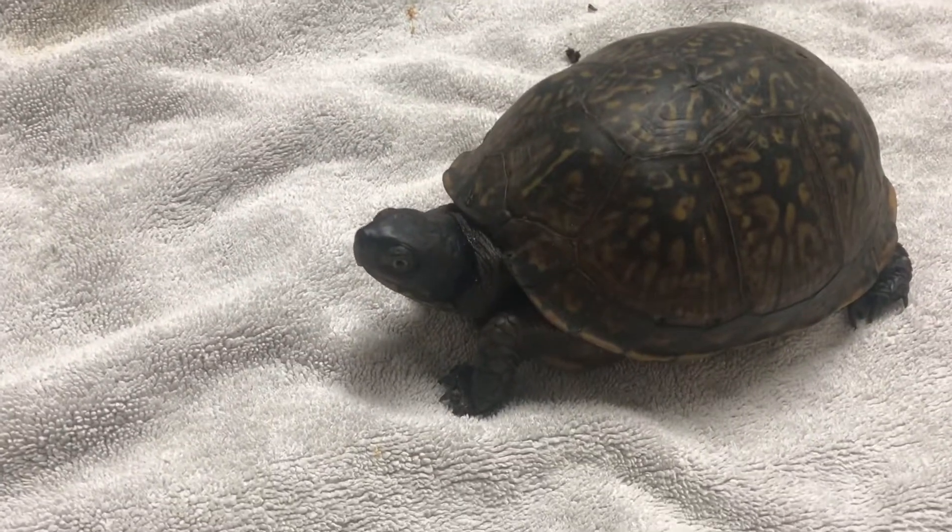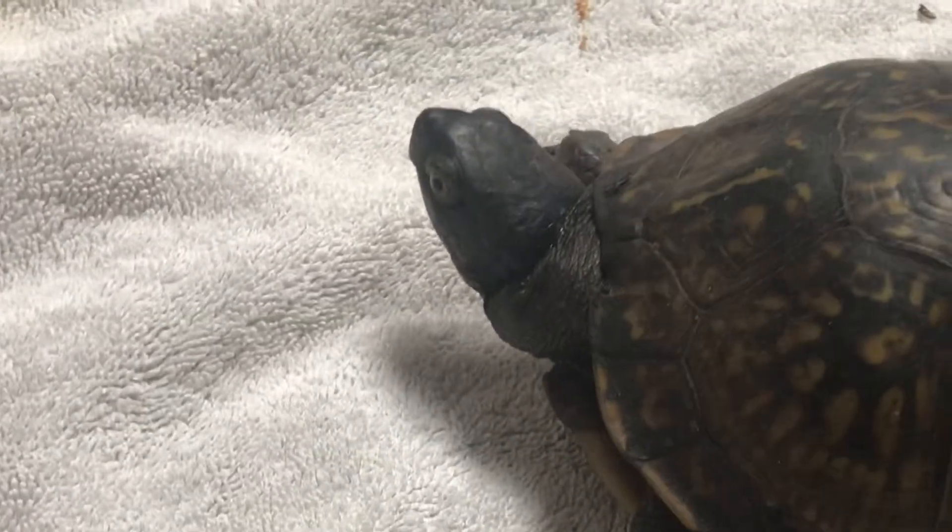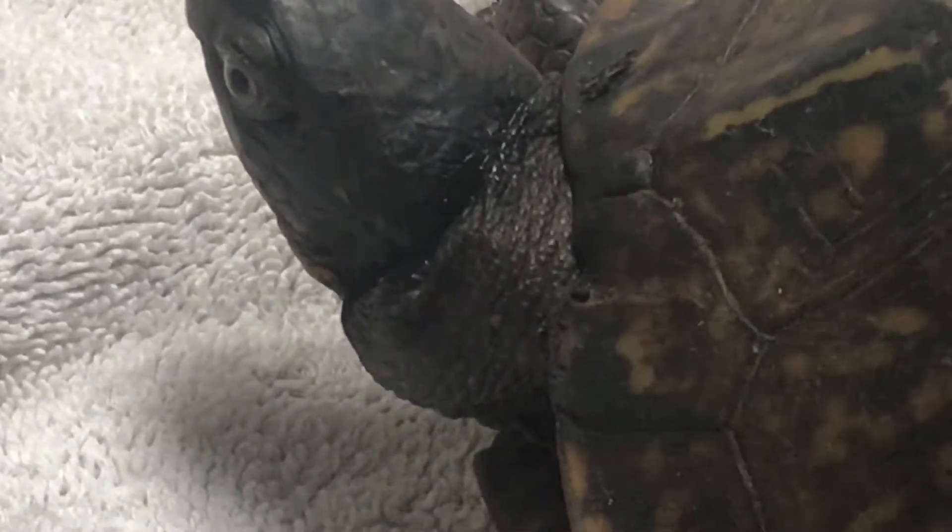This turtle was brought in today with a swelling on the left side of his neck. Although he was hiding earlier, I can now see there is a swelling. We're going to sedate him real quick, figure out what's going on with that swelling, and then take it from there.